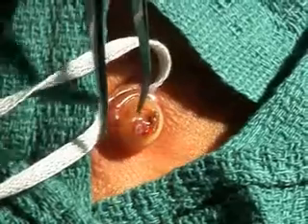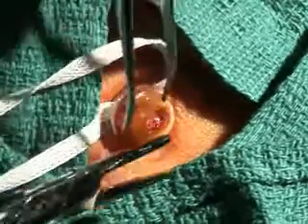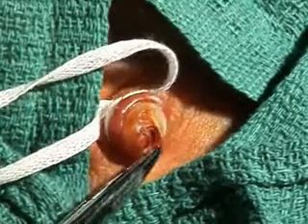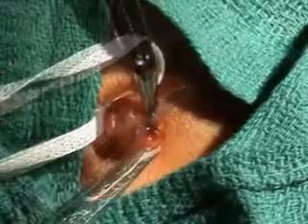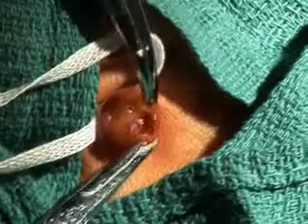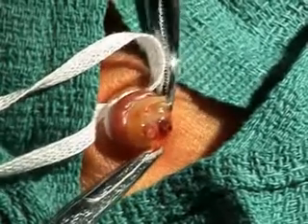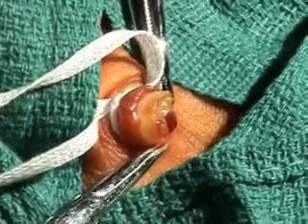The assistant should use the toothed mosquito hemostat to grab the side of the cord near the artery to be cannulated, and should avoid grabbing the artery. Clamp a curved hemostat to the opposite side of the cord. The assistant should apply traction to these hemostats in opposite directions to stabilize the cord.